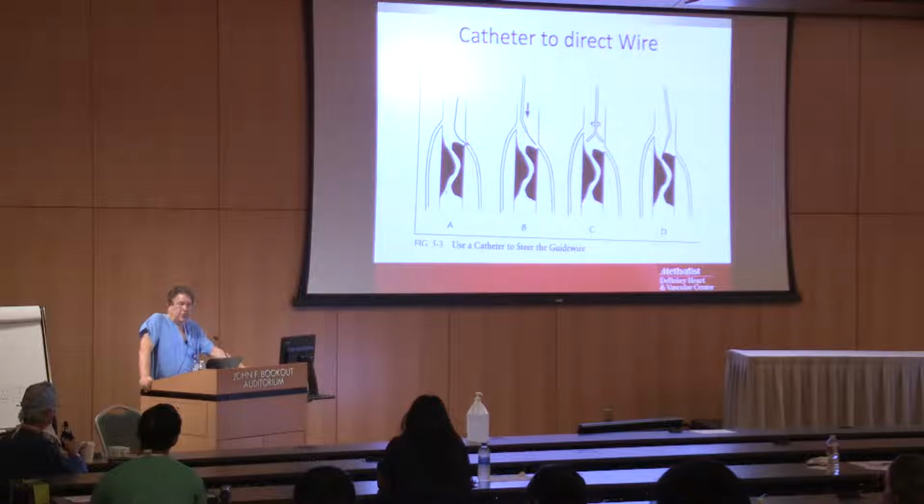And so there are certain iliacs that are a little bit higher risk than others. I mean, it's pretty unusual to bust an iliac just with an angioplasty and a stent. It's not at all uncommon to bust an iliac trying to put a humongous sheath up inside the artery for either TAVR or for a stent graft. And it's very important to communicate with anesthesia. So when we're pre-dilating an iliac trying to get a 22 French sheath up, for example, we'll make sure the anesthesia attending is in the room, and we'll be telling them to keep an eye on the pressure when you take that balloon down.